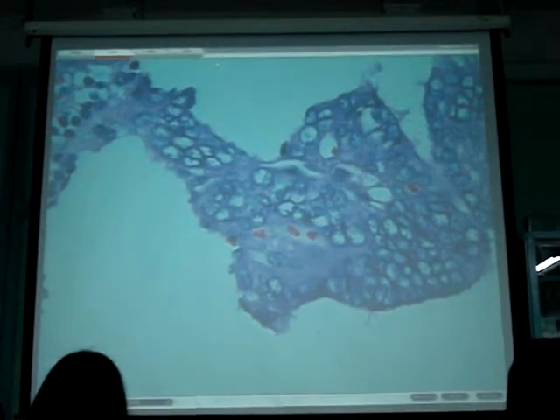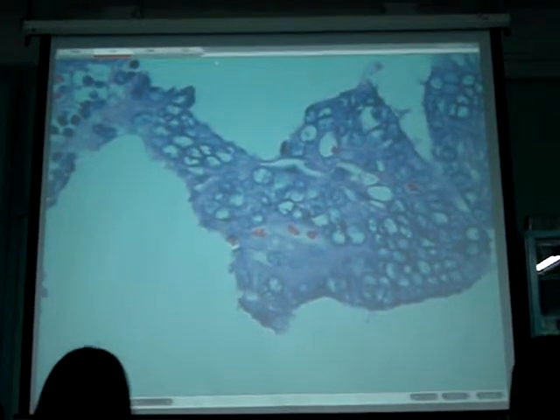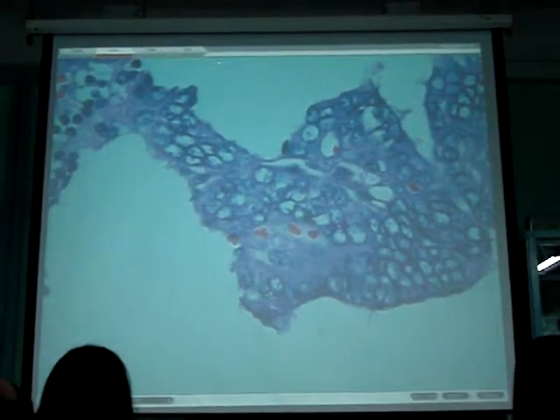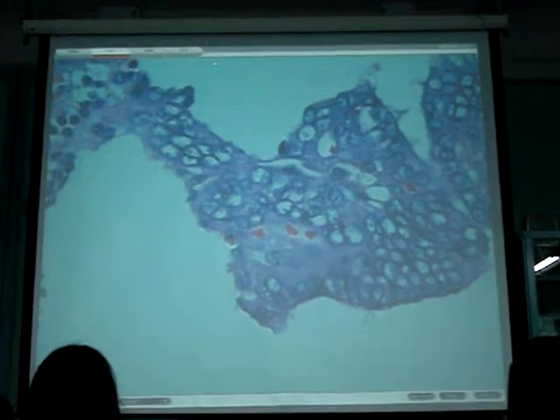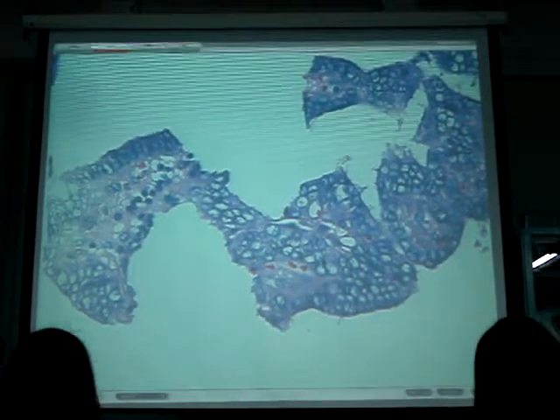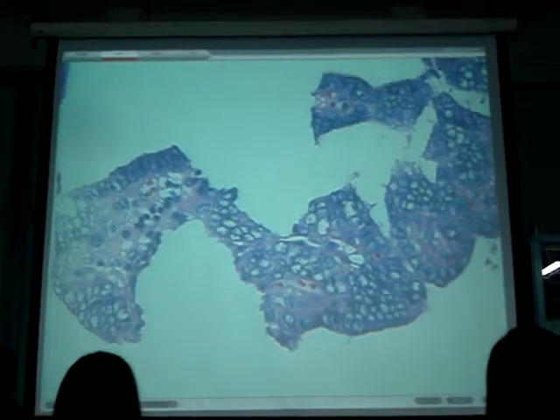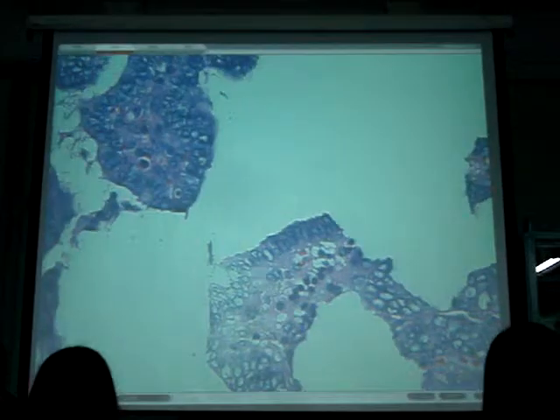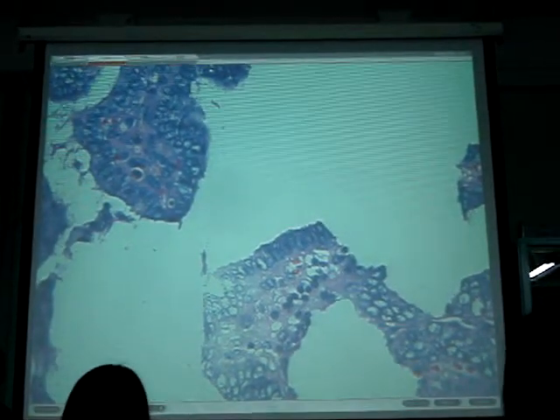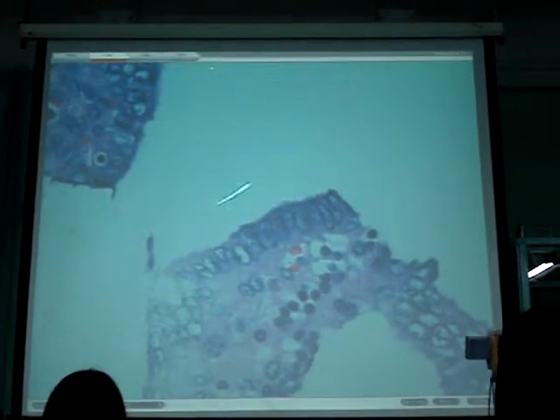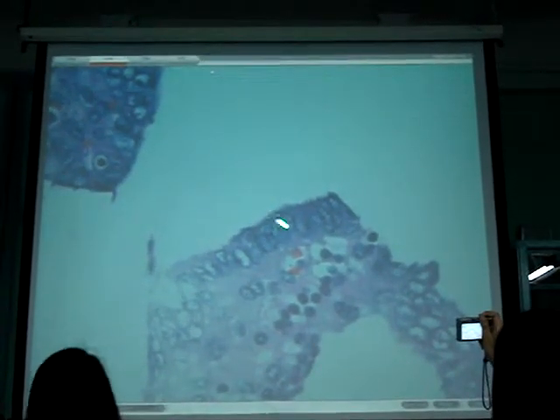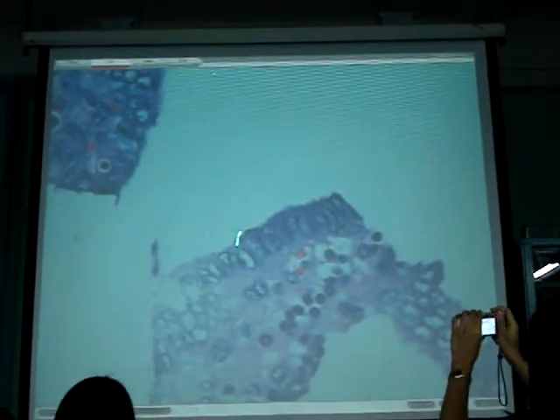Aside from nuclear clearing, in other pictures you should also see nuclear grooving. And also nuclear palisading — the nuclei line up like picket fences. That's nuclear palisade.